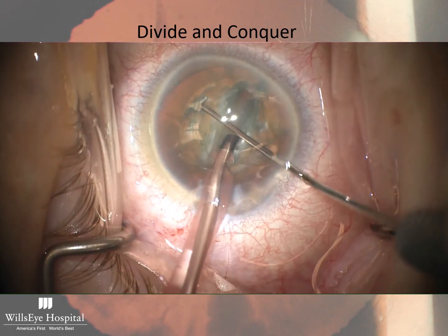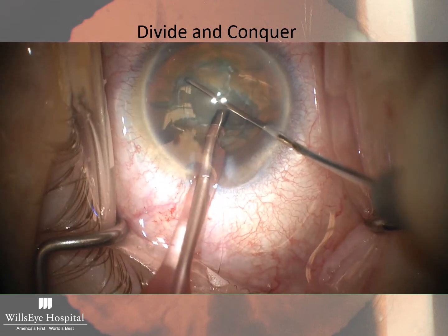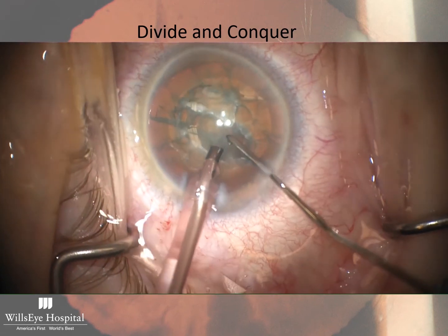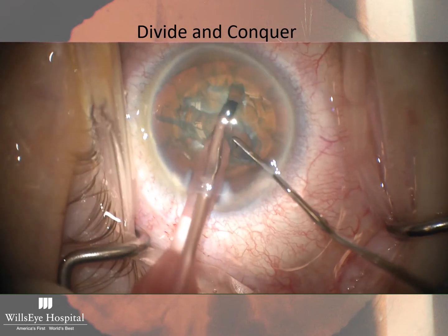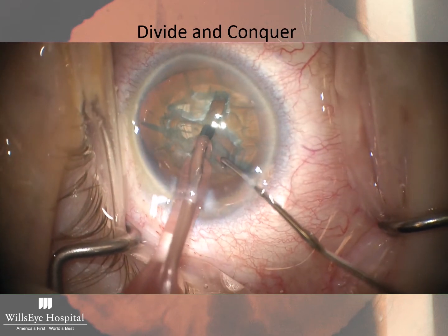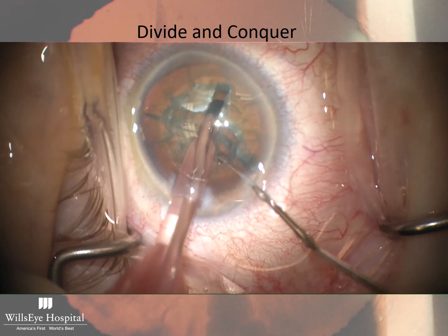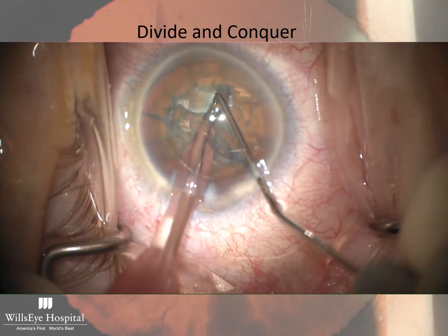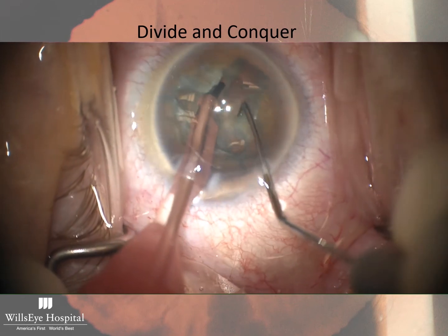So I'm going to rotate 90 degrees. I either drop my second instrument in or I go to the wall of the groove. Then I'm going to start my second groove. I like to take a little bite off of the edge of the heminucleus proximal to me for the first few passes, and then I'll concentrate on the more nasal groove there. Once you create your initial groove and crack, it's always easier to crack the secondary groove. So here again, nice slow spread.